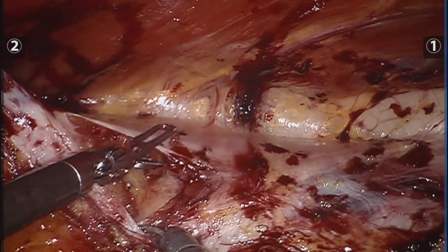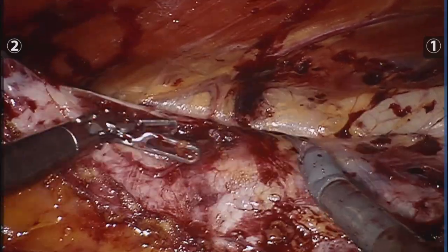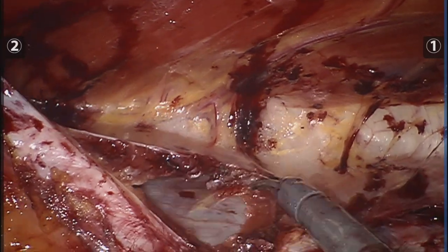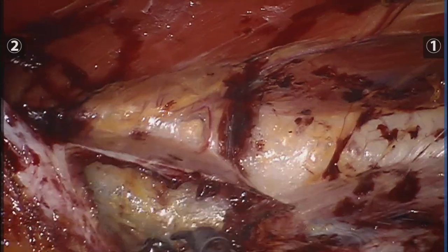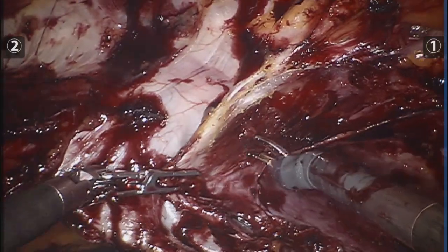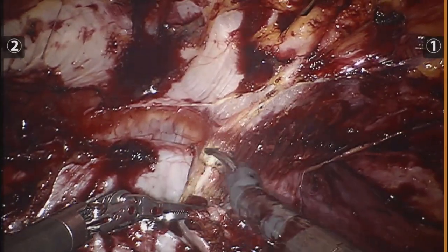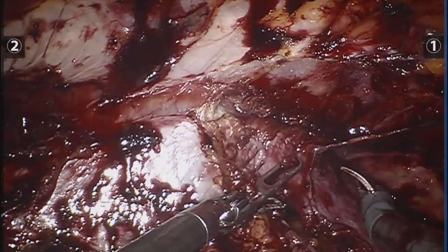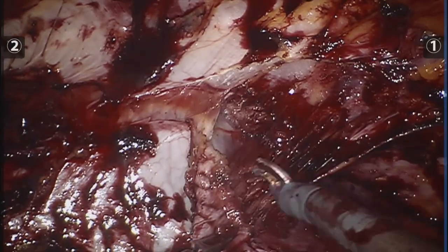If I had to choose, I probably would not have chosen a TAR to be my second robotic case, but there aren't many chances here to find patients for robotic surgery, so I really had to tackle this and be very well coached by Dr. Javier Curi. There I'm continuing the TAR bottoms-up, connecting the dots between the dissection top to bottom, and these last muscle fibers are going to be released.